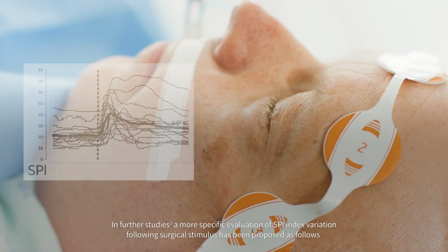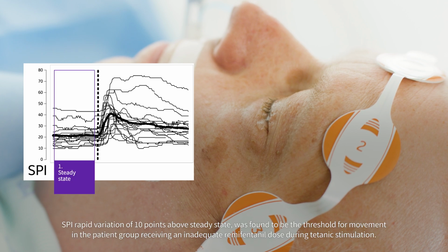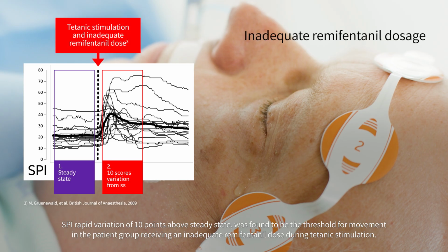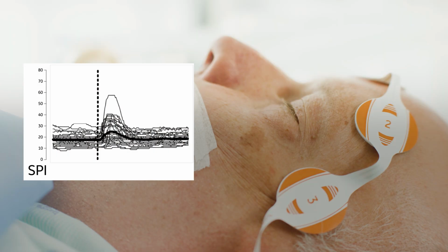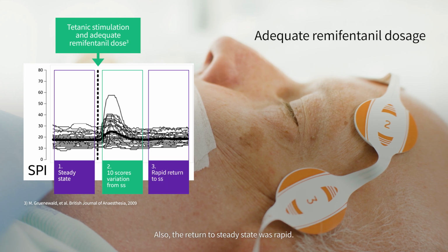In further studies, a more specific evaluation of SPI index variation following surgical stimulus has been proposed as follows. SPI rapid variation of 10 points above steady state was found to be the threshold for movement in the patient group receiving an inadequate remifentanil dose during tetanic stimulation. In this group, the return to steady state was slow and prolonged. On the contrary, patients in the control group receiving an adequate remifentanil dose during tetanic stimulation only manifested a slow and slight SPI deviation from steady state. Also, the return to steady state was rapid.